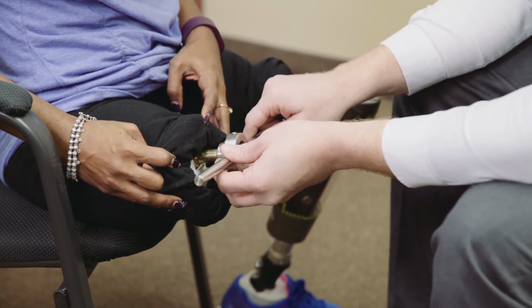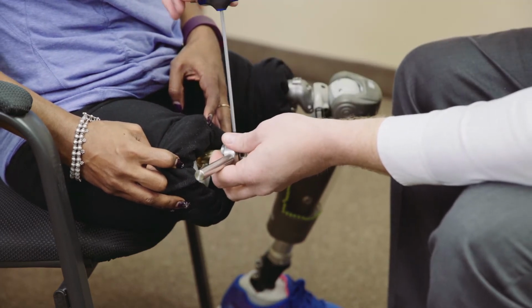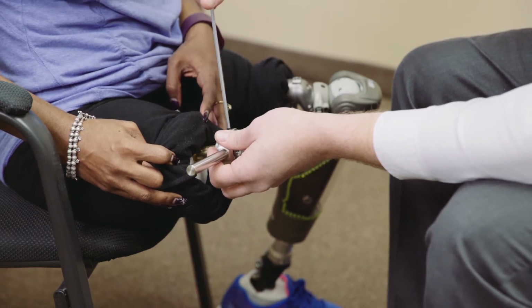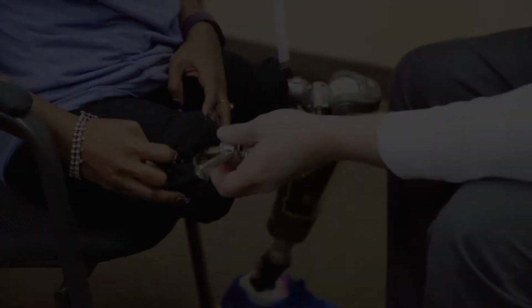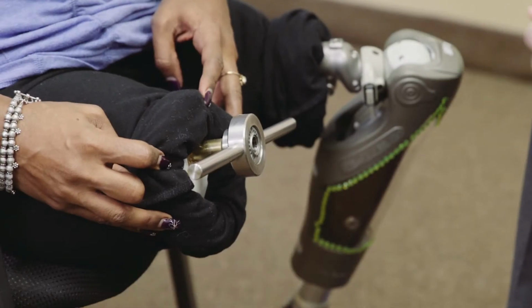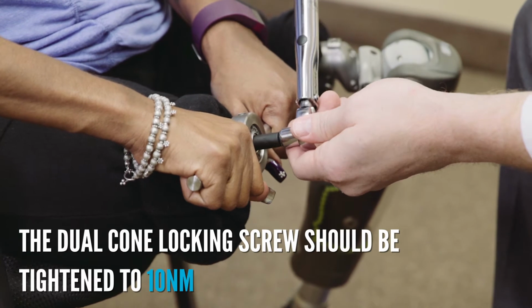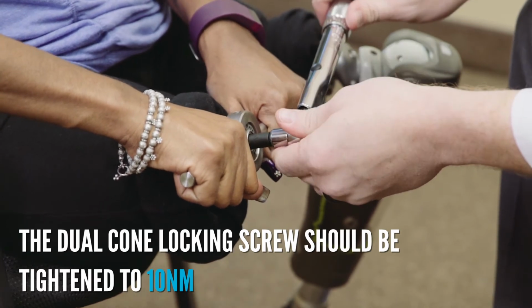their activity level. To access this screw, you must remove the prosthetic components as well as loosening the bushing and taper sleeve. Once these are all loosened, install and stabilize handles into the groove on the taper sleeve. Again, have the patient or helper firmly stabilize the implant by holding the handle steady.